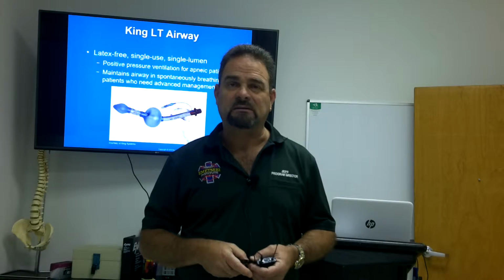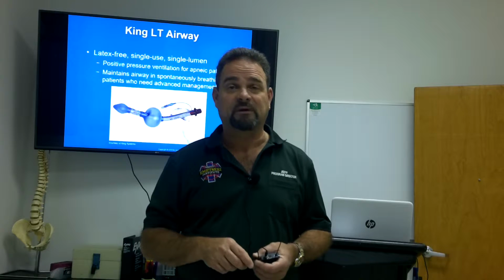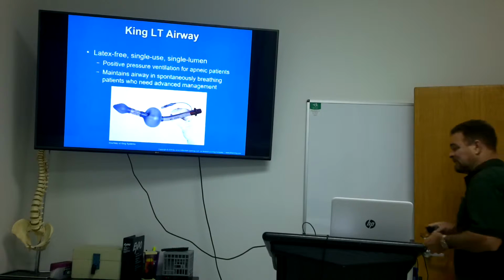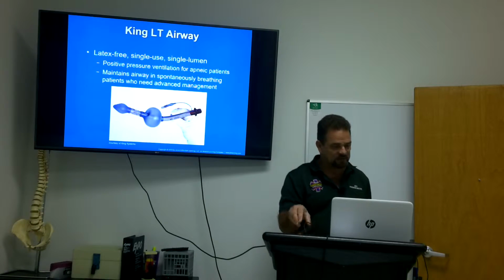All right, welcome back. This is lecture 6, last lecture, yay, of airway management. We have gone through a lot of slides. This last section is going to go over some of our different types of airway adjuncts or advanced airway adjuncts.